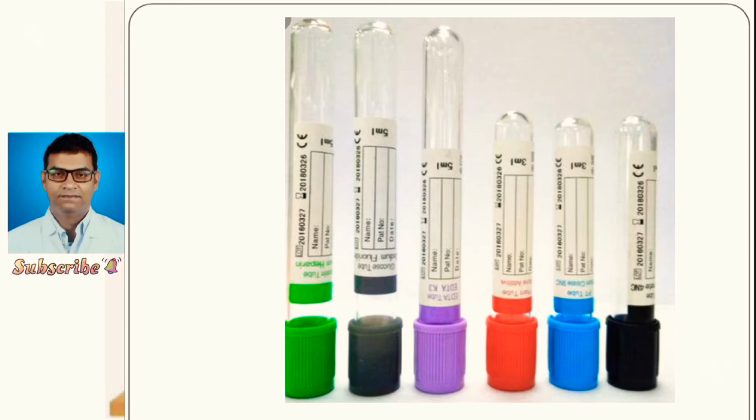complete blood count. Excess EDTA, that is more EDTA, will reduce the blood volume. An excess of EDTA will cause shrinkage of the RBCs, causing falsely reduced hematocrit and a subsequent increase in the MCHC and decrease in MCV. Platelets are also affected. They will swell and subsequently disintegrate, causing an erroneously high platelet count, since platelets will disintegrate into more than one fragment, and each fragment will be counted as one platelet.